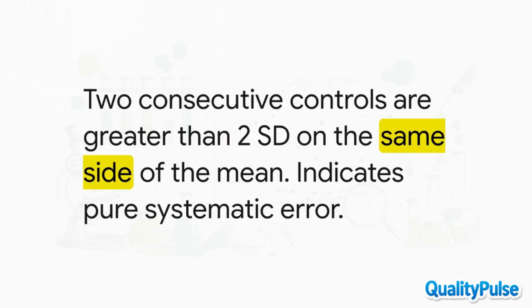Okay, let's look at the 2-2s rule. This triggers when 2 consecutive control results fall greater than 2 SD on the exact same side of the mean. This one identifies pure systematic error. It's essentially warning you of a systemic bias affecting your testing curve. And your required action here? You guessed it, reject the run.